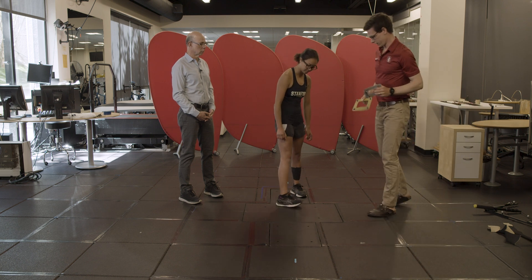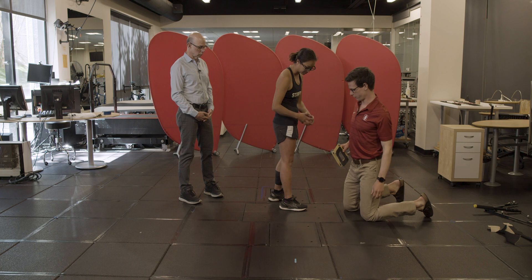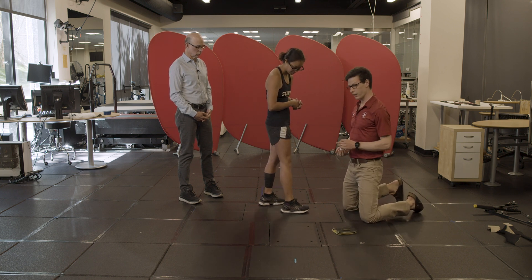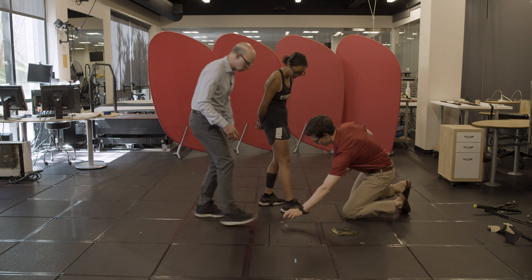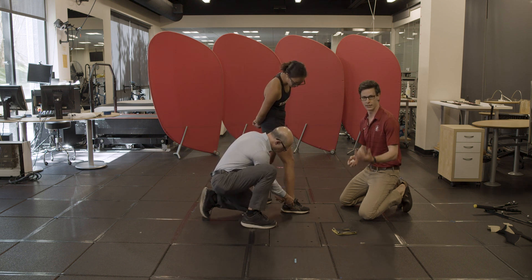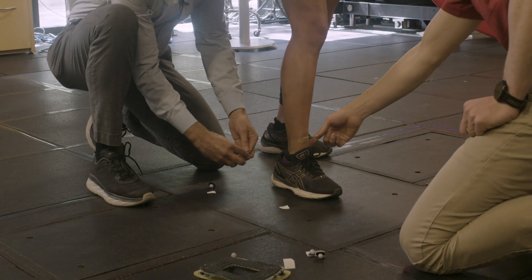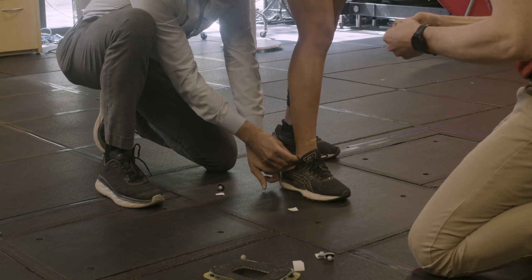We're going to assume that her foot is a single rigid body — which it's not — but for the purposes of today, we'll say that everything is rigid in the foot. We need a minimum of three markers that aren't collinear in the foot. We're looking for very repeatable locations identifiable in every single subject. Two great places are the medial and lateral malleolus, which are the bumps on your ankle.